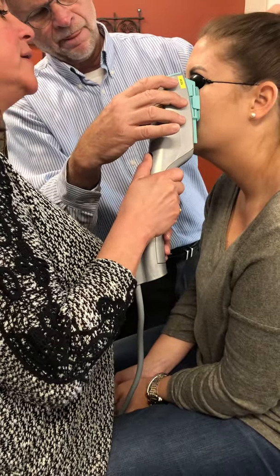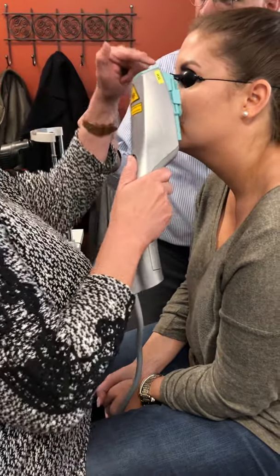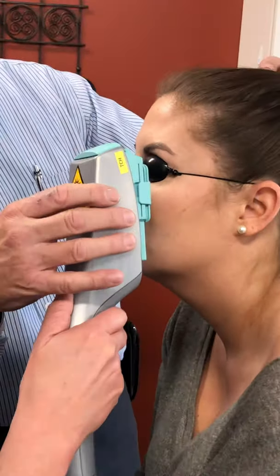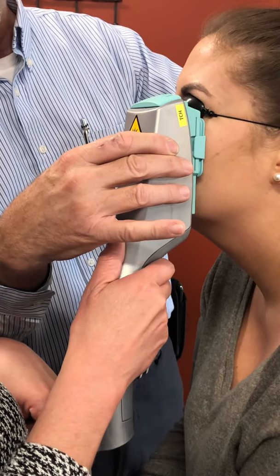Okay, so I'm looking at the halfway point of the notch, on the halfway point of the goggle, and that's where it's basically touching the nose and right there. That's going to be treatment number 1. Treatment number 2, right there. See how we're overlapping?